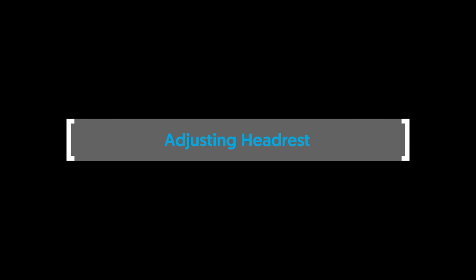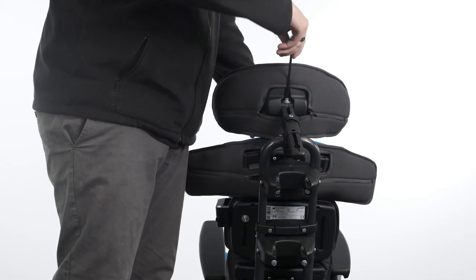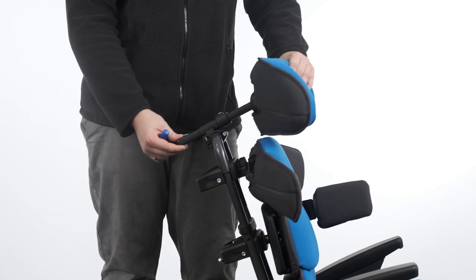Adjusting the headrest. To adjust the headrest, loosen the bolts. Adjust the headrest height, depth and angle into the desired position. Tighten the bolts to secure in place.